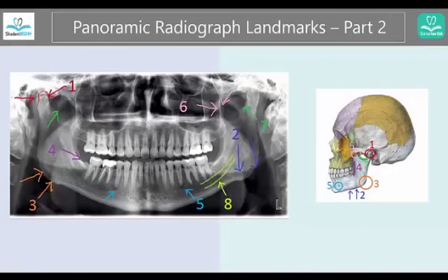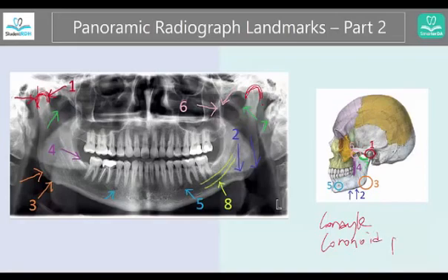Number one is this guy over here — this protruded, rounded part. This is either the condyle or the coronoid process. Which one do you think it is? The answer is the condyle. The condyle is the area that rubs against the temporal bone, and together they form the TMJ.